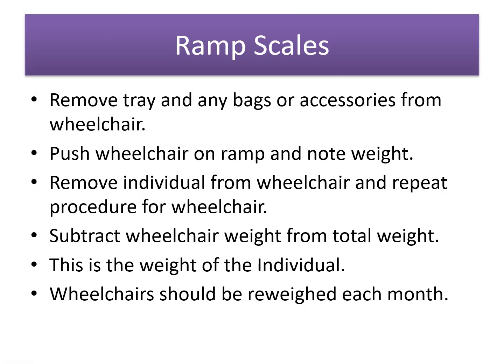Utilizing ramp scales, you must remove the tray and all bags or accessories from the wheelchair. Push the wheelchair on the ramp and note the weight. Remove the individual from the wheelchair and repeat the procedure for just the wheelchair alone. Subtract the wheelchair weight from the total weight. This is the weight of the individual. Wheelchairs should be reweighed each month when the individual is weighed.